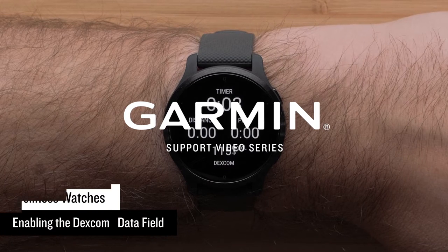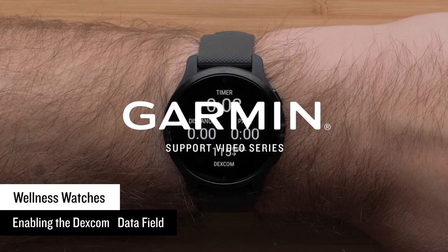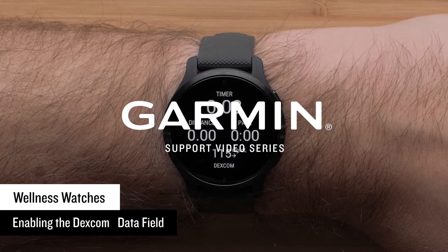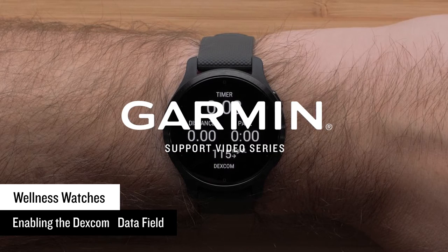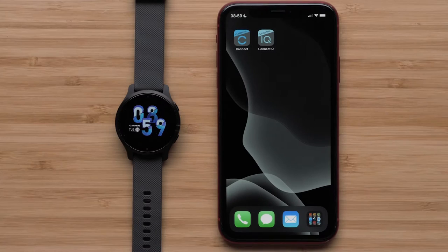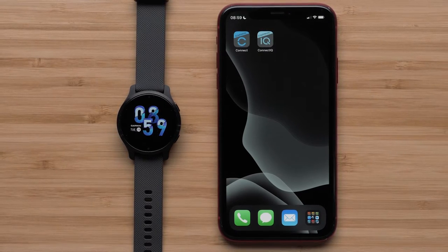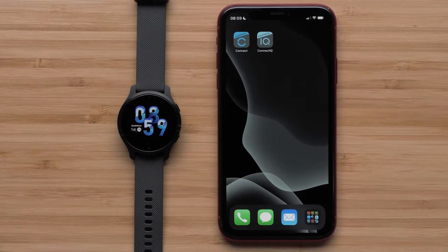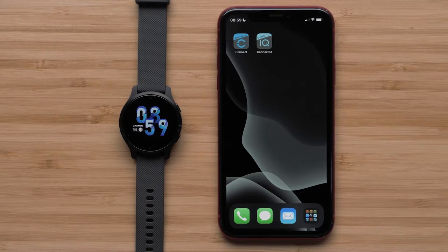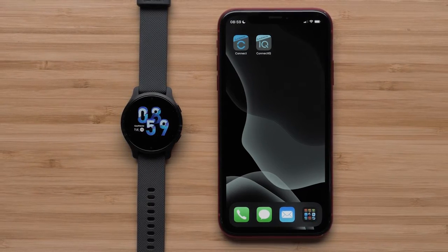In this video, we will show you how to enable the Dexcom data field on your Venue, Vivoactive 4, Legacy Hero, or Legacy Saga series watch. To enable the Dexcom data field to see your glucose number recorded by your Dexcom continuous glucose monitoring system, you will need your watch and compatible smartphone.